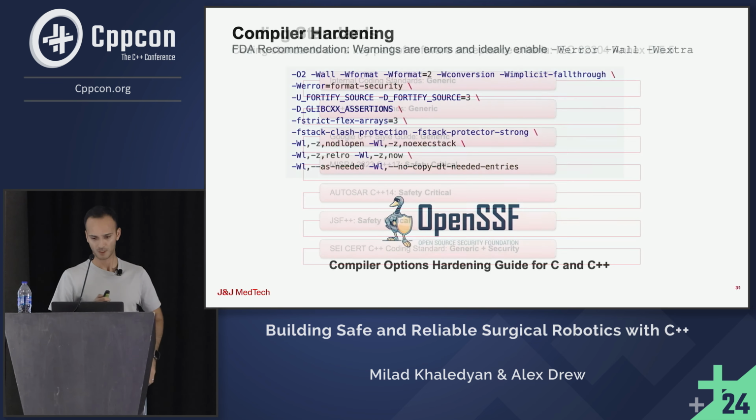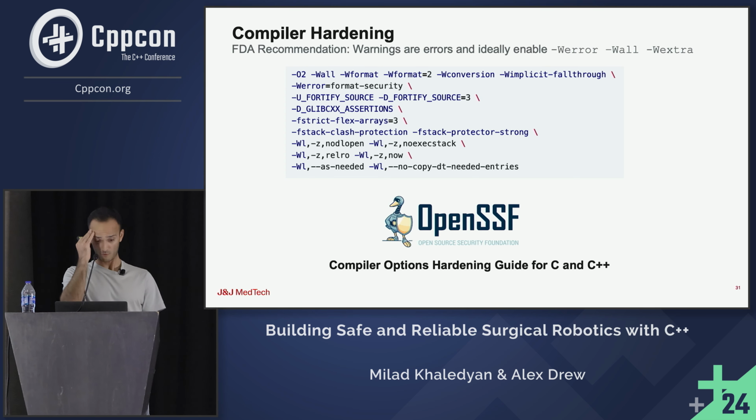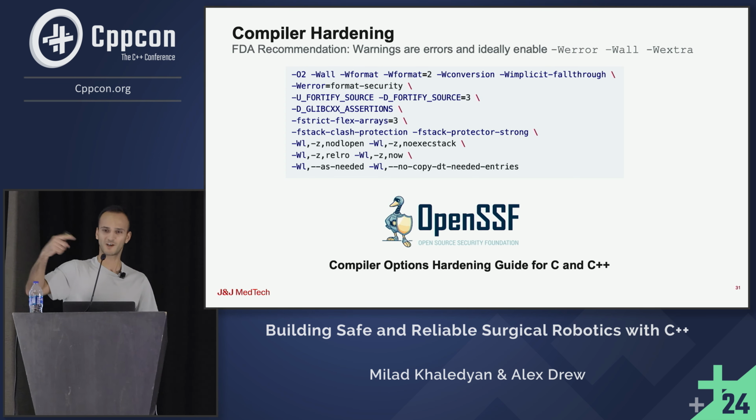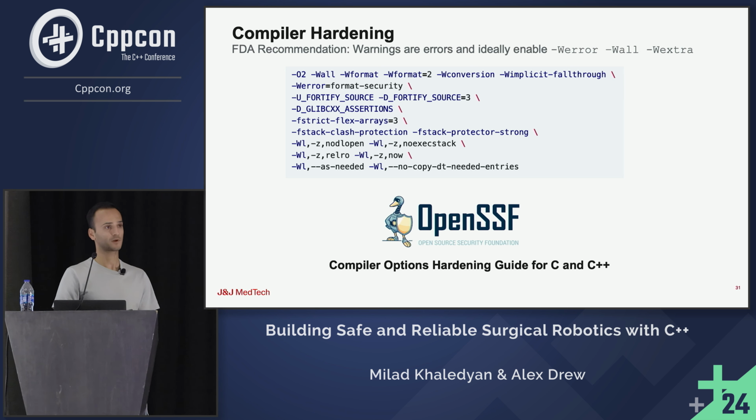Compiler hardening, I think today in the keynote speaking, I wish my talk was before that, then they would say she copied me, not that I copied her. Compiler hardening is very important. Specifically, you have to do it much earlier in the project. You can actually use OpenSSF.